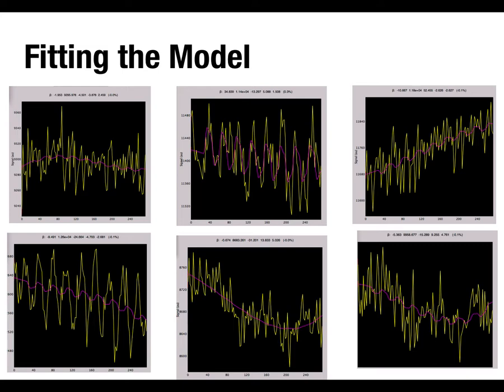And of course here I'm using a block design, which is a very obvious one to look at. If you imagine those jittered event-related designs I showed you, where it could be any old time course, but we know it's systematically what we predict the bold response to be based on our stimuli, you wouldn't be able to eyeball that, so you'd rely on the math. I mean, you always rely on the math anyway. But again, you just see which brain area is correlated strongly with that time course.